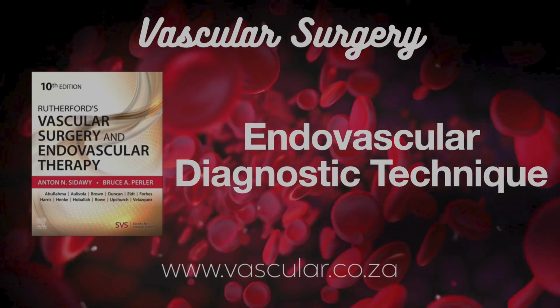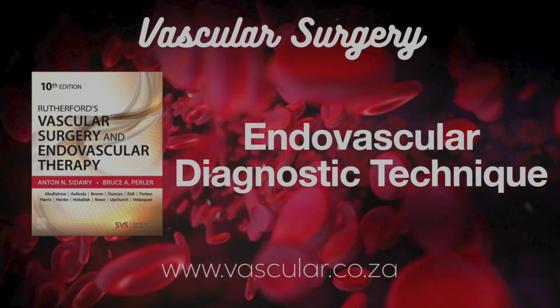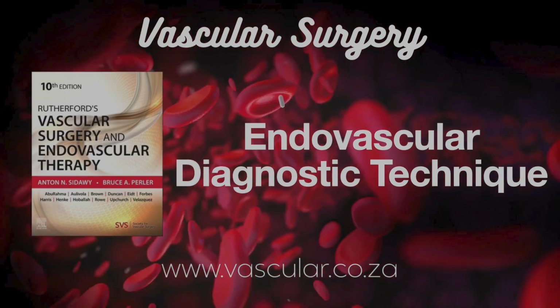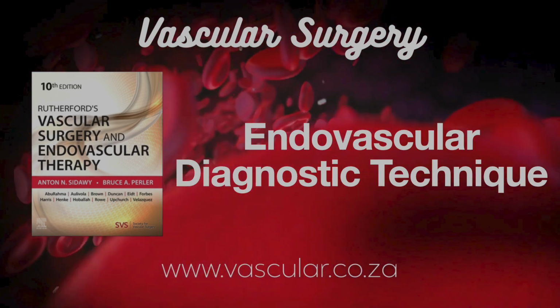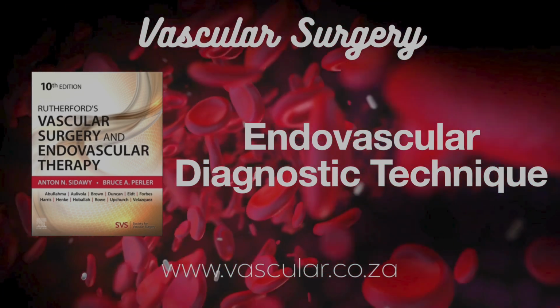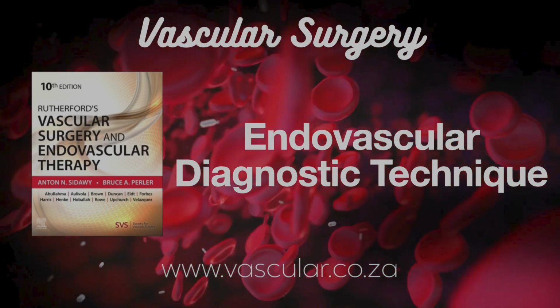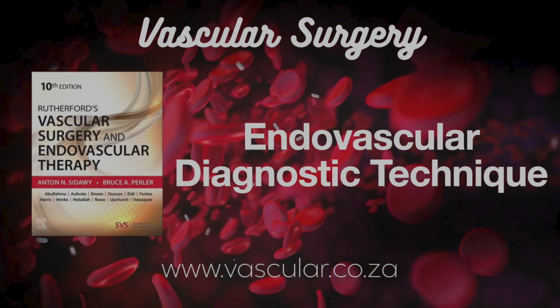And you mentioned the inguinal ligament and femoral head. We also use bony landmarks under fluoroscopy. That's like live x-ray. Right. You can see the femoral head clearly. And also the top point of your hip bone, the superior iliac spine, and the pubic tubercle. These help pinpoint where the CFA ends and the external iliac begins, basically above the inguinal ligament. So people sometimes draw the ligament on the skin. Yeah, some practitioners do that as a visual guide, especially when starting out or if the anatomy is tricky.